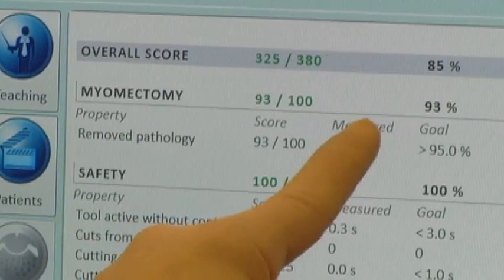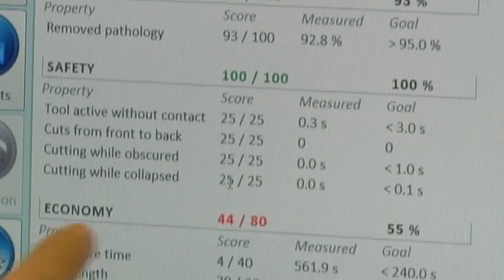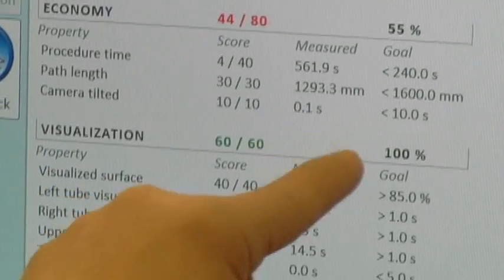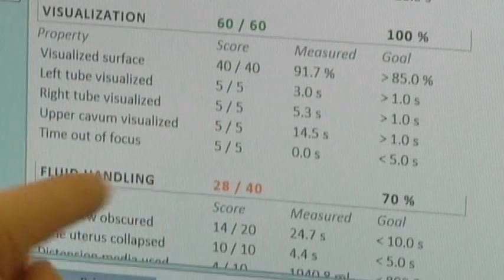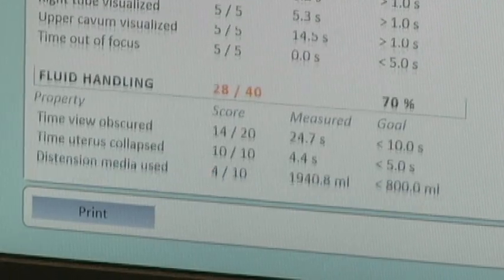Here for the myomectomy I got 93%, for safety I got 100%, for economy it took me a little longer so I got 55%, for visualization I got 100%, and for fluid handling I got 70%, probably related to the fact that it took me a little longer.